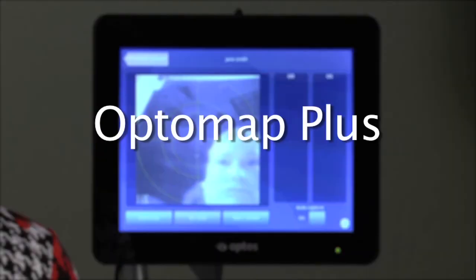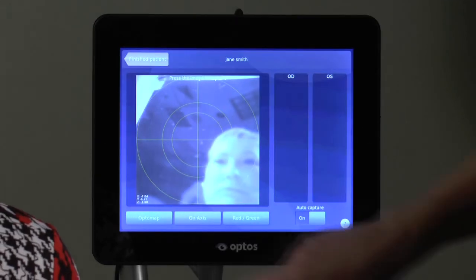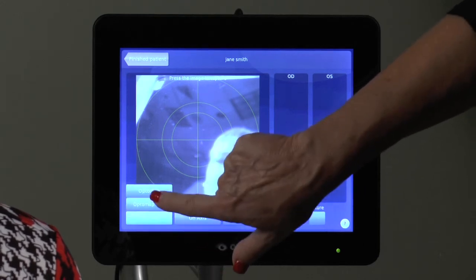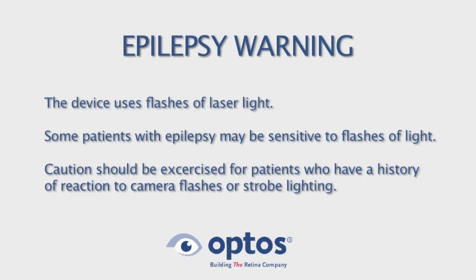The Daytona system allows you to capture a Screening Optomap or an Optomap Plus, which is a higher resolution image for a medically necessary procedure. If this feature is available on your system, simply touch the bottom left tab and select Optomap Plus to activate.